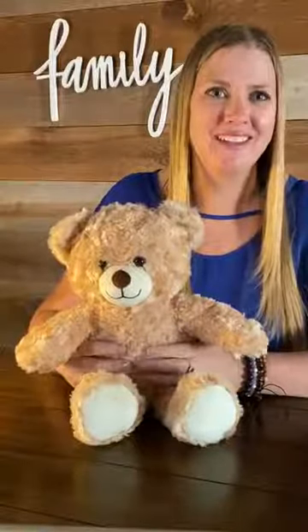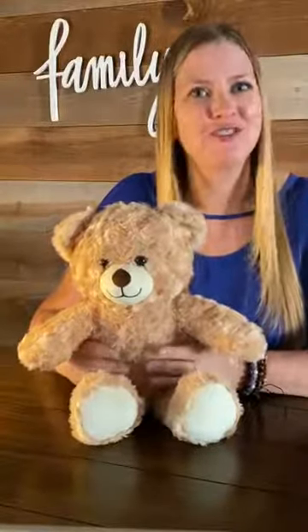Hi, I'm Jenny, the voice of MediTeddy. I'm here to show you how to use your MediTeddy.